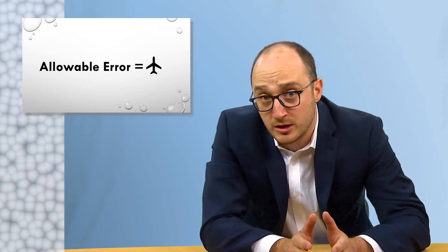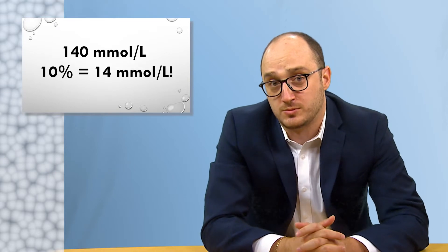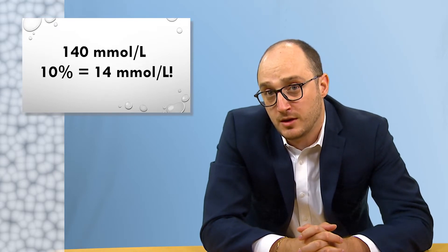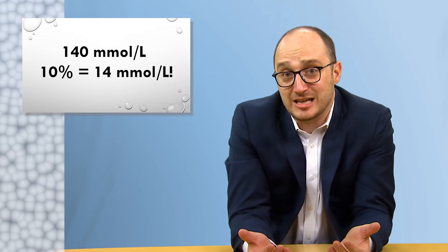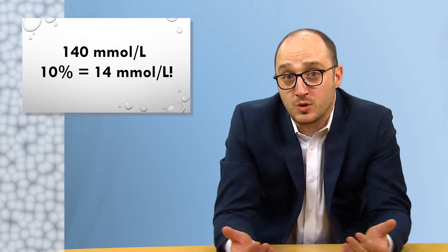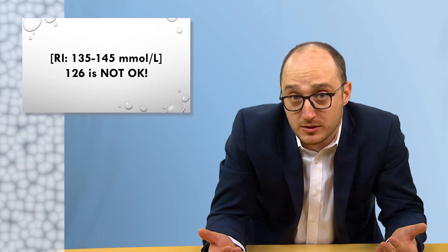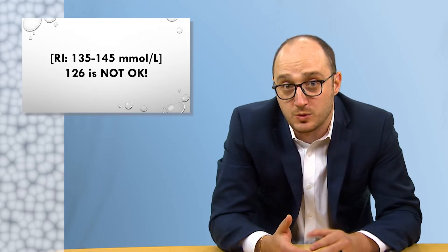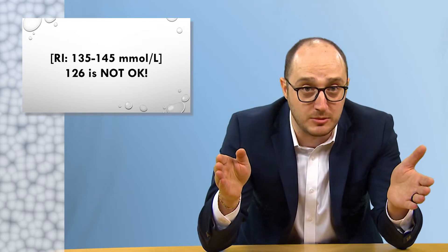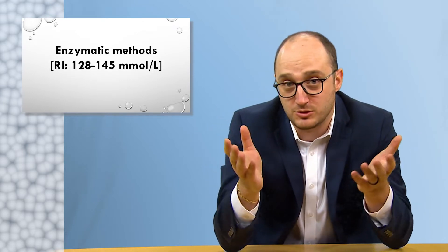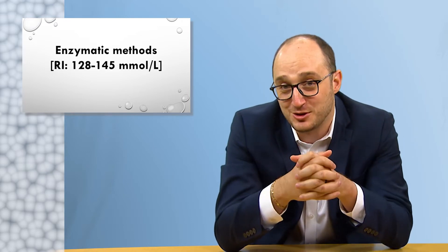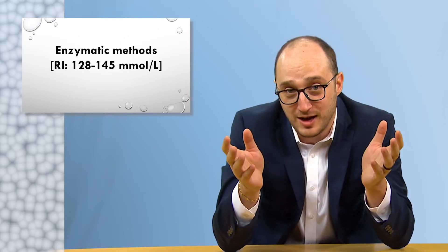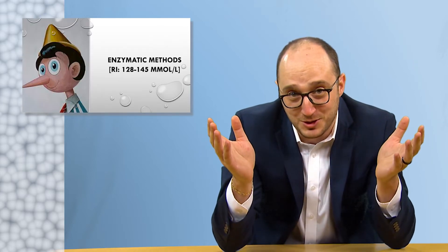10% represents an allowable difference of plus or minus 14 millimoles per liter for plasma sodium. For a patient with a sodium concentration of 140 millimoles per liter, that's saying it's okay if we report down to 126 millimoles per liter — the difference between almost severe hyponatremia and normal natremia. Unless, of course, you're using an enzymatic method to measure sodium, in which case, with a reference interval of 128 to 145, you have other villains to worry about.